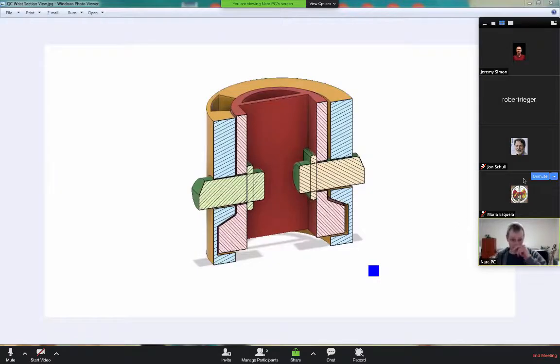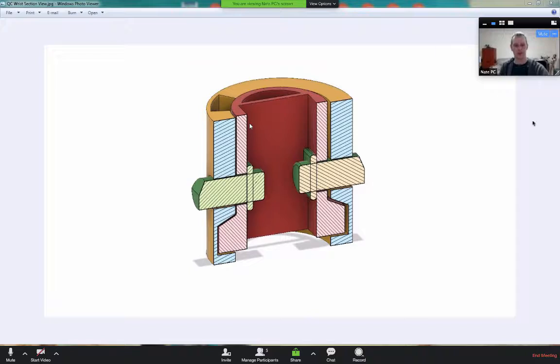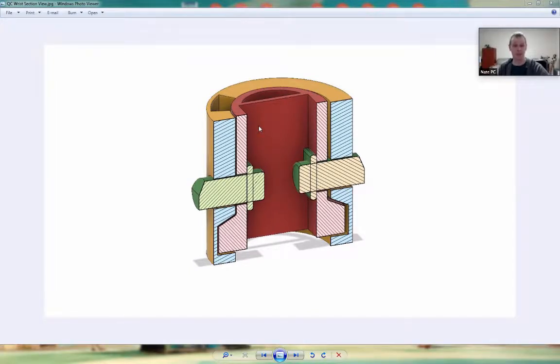Sounds good. Okay, so here is the quick connect wrist, a section view of it. This is what Alex has been working on. The red section is actually what would be attached to the palm, and the groove, this is in progress also, and I have to apologize. Alex did an amazing job with this whole thing, and I don't want to slight her in any way, because this is basically what I wanted, but we will probably be turning the groove the other way around. That was my bad for not explaining it to her the way I needed it done, but she did an incredible job here in general.